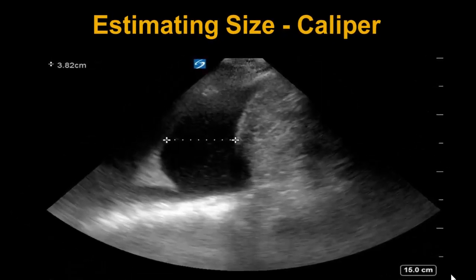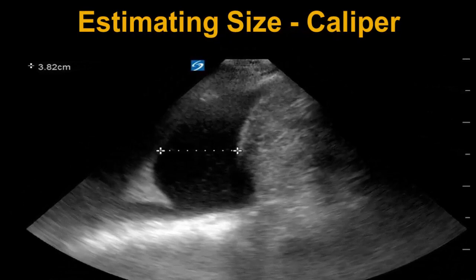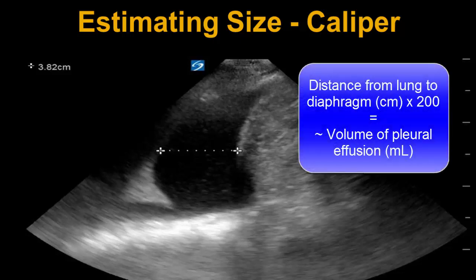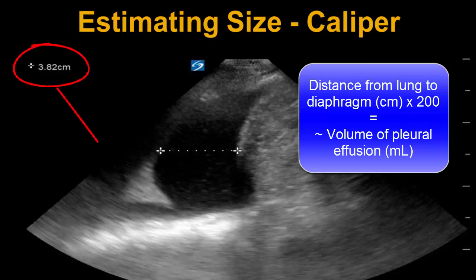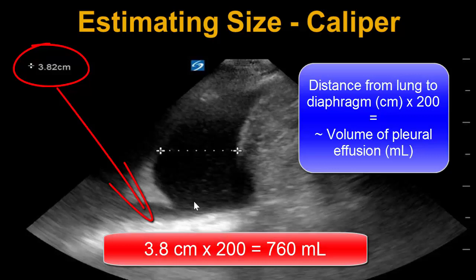Apart from the qualitative eyeball method used to estimate the size of a pleural effusion, it is also possible to estimate its size quantitatively using a simple calculation. The volume of a pleural effusion is equal to 200 mL/cm multiplied by the caliper distance between the inferior edge of the lung and the superior edge of the diaphragm in centimeters. So, in the case above, it would be 3.82 cm multiplied by 200 mL/cm, giving a total estimated volume of 760 milliliters.